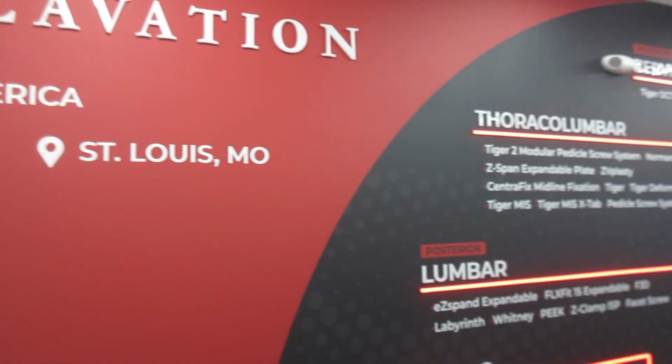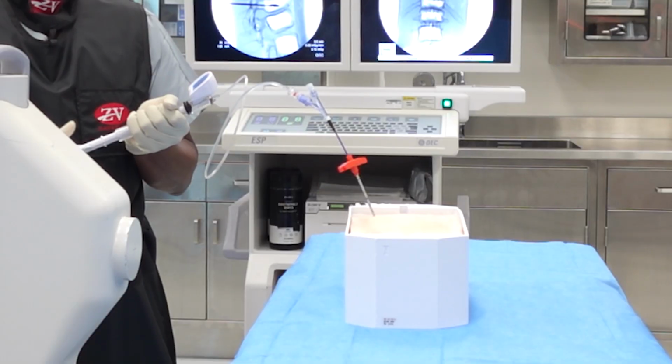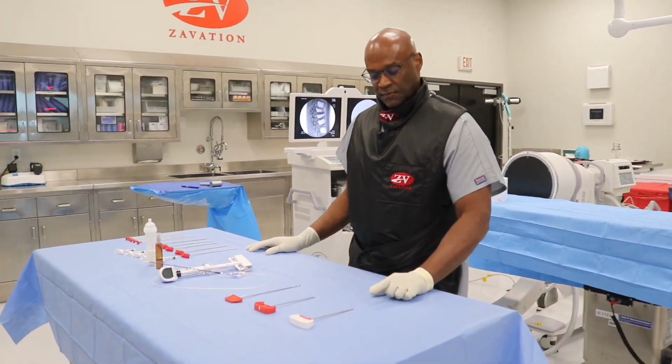Today we're going to discuss the procedure involved with using the ZVplasty balloon system for bone cement using a unipedicular approach. These are the different components for the system.